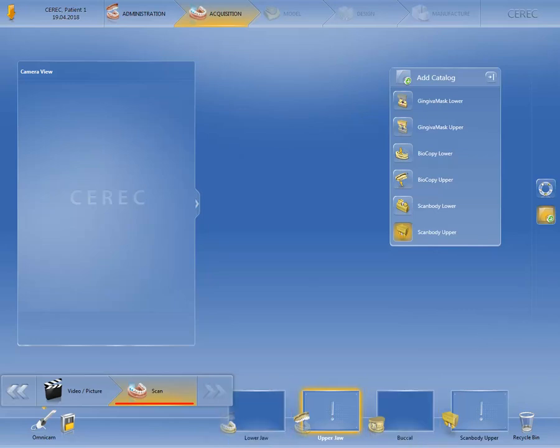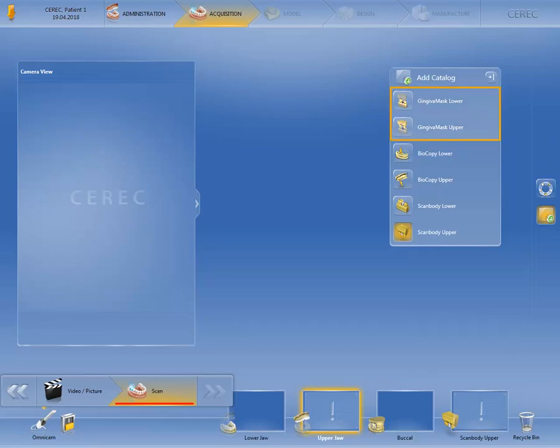Through the side palette, we have opened the add catalog option and will now look at this in more detail from top to bottom. The two image catalogs, gingiva mask lower and upper, can be added optionally if the scan process for the quadrants with the implant to be restored took too long and the gingiva collapsed once the gingiva former was removed.